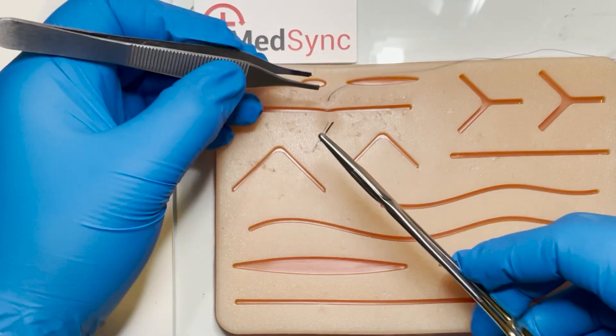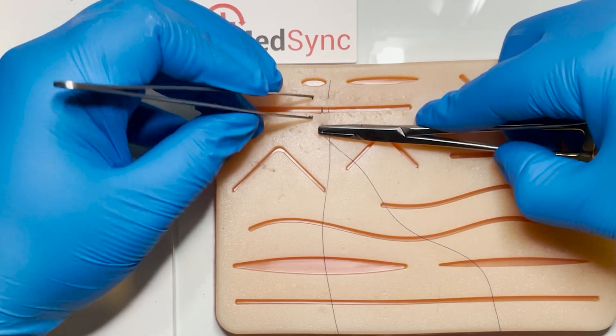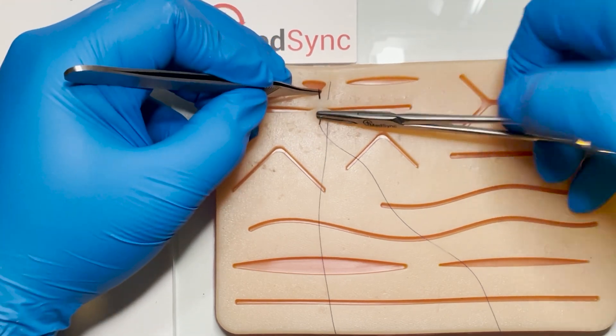In this video, we highlight two techniques that will minimize this. The first, as seen here, is a two-instrument, two-step maneuver.